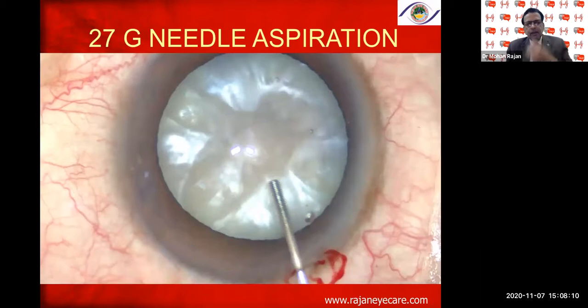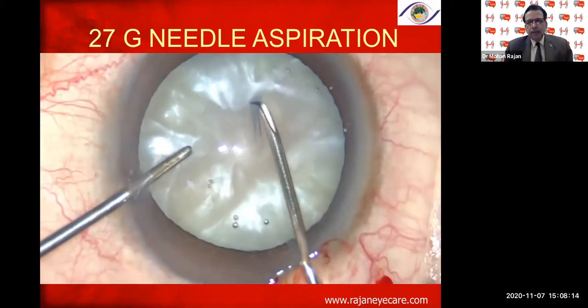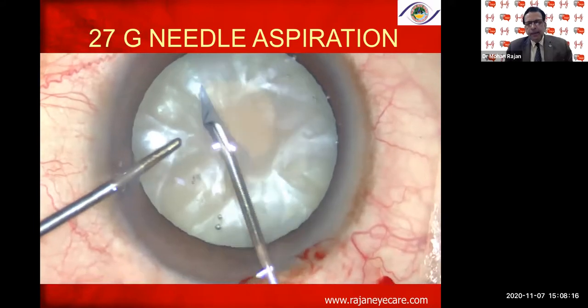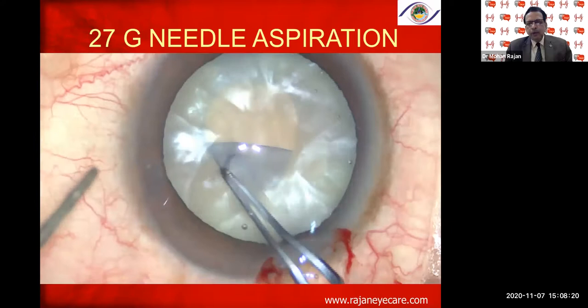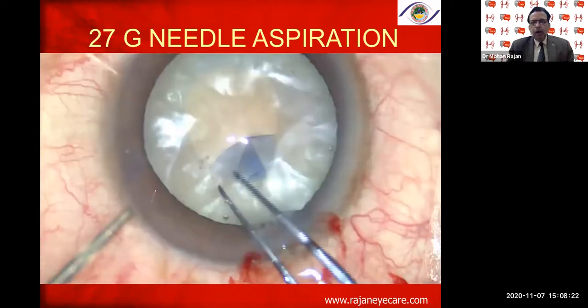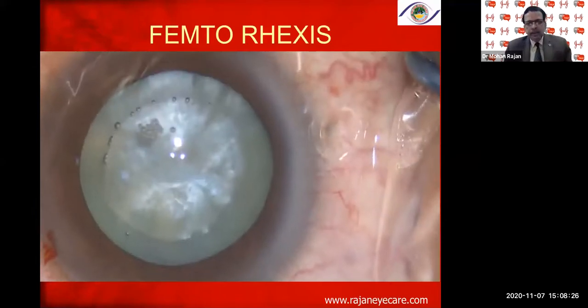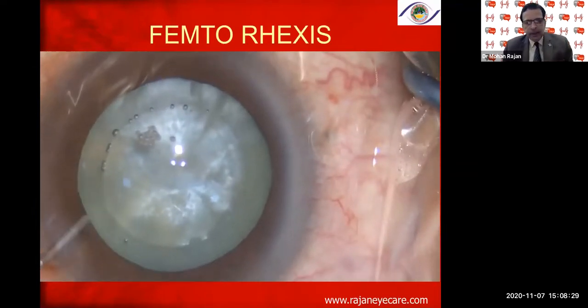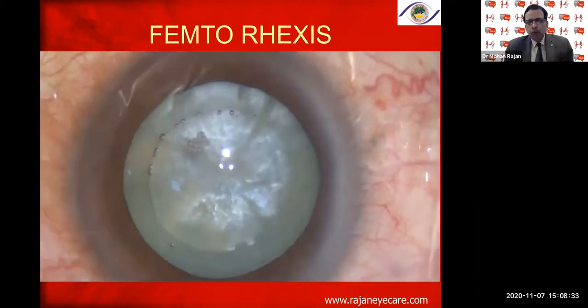The intercapsular or interlenticular pressure is the main problem in the Argentina flag sign. Once you decompress the anterior compartment, the front compartment, then you can go around and do the capsular rhexis without any problem. Or if you have access to the Catalys or the FEMTO, you can do the femto rhexis, which I'm doing for all the mature cataracts nowadays, because it's almost 100% foolproof.